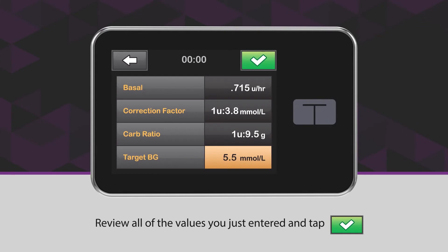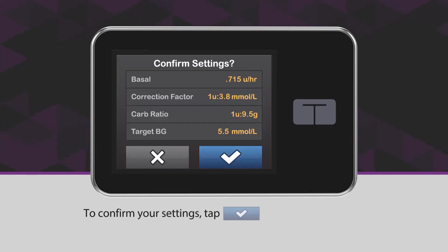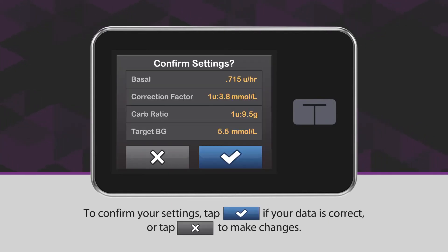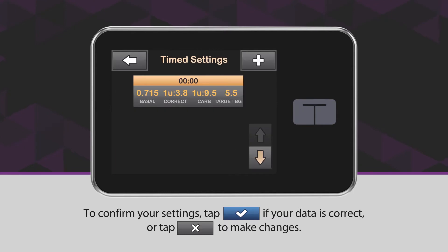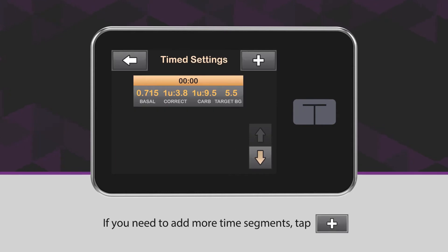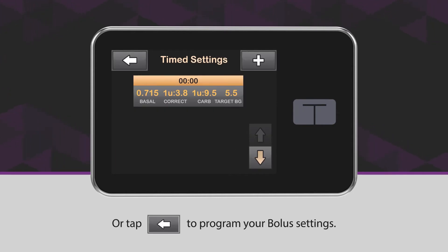Review all of the values you just entered and tap the green checkmark icon. To confirm your settings, tap the blue checkmark icon if your data is correct, or tap the X icon to make changes. If you need to add more time segments, tap the plus icon, or tap the back arrow icon to program your bolus settings.